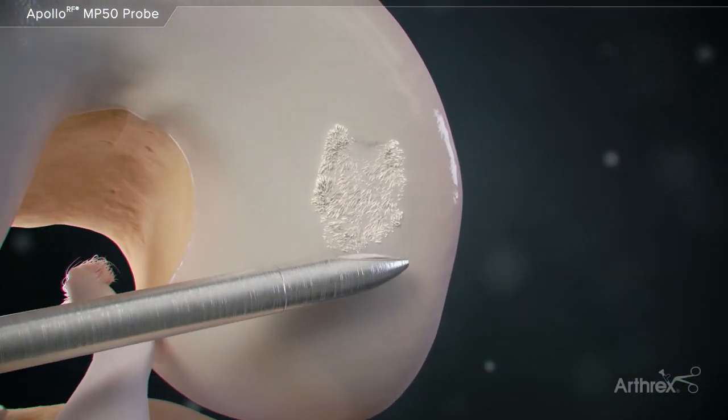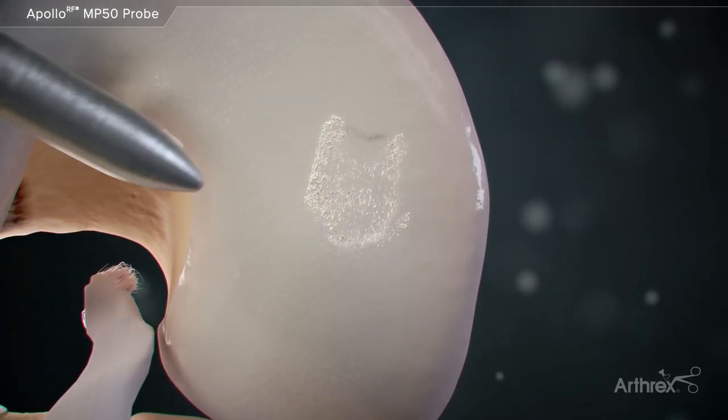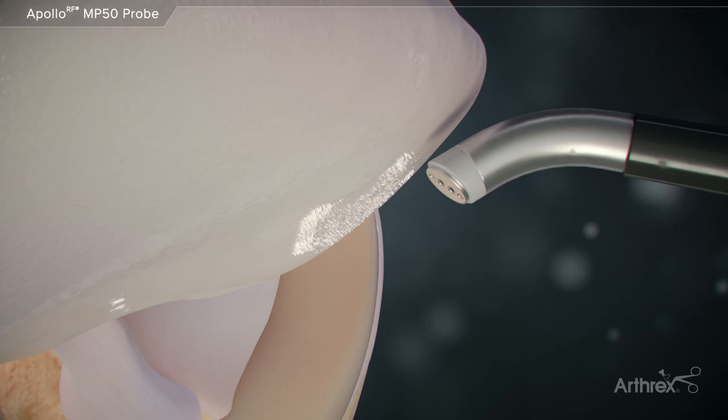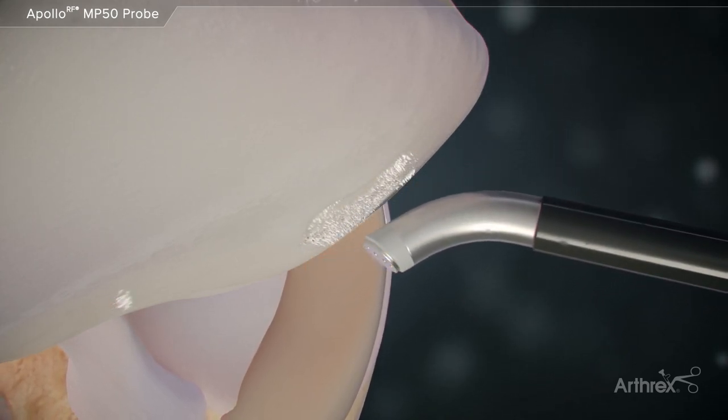The MP50 can also assist in chondroplasty procedures. The reduced energy setting and edge control lightly ablate frayed cartilage fibers with minimal effects to adjacent tissue.